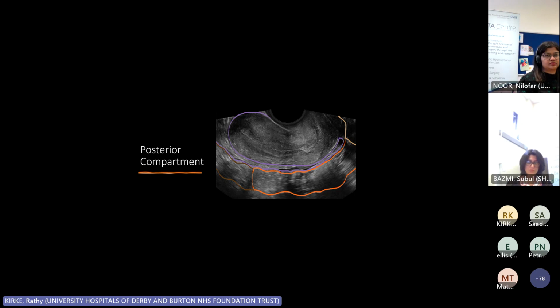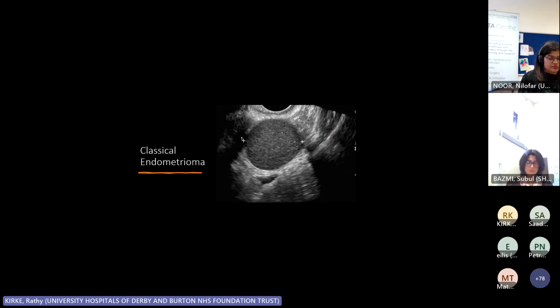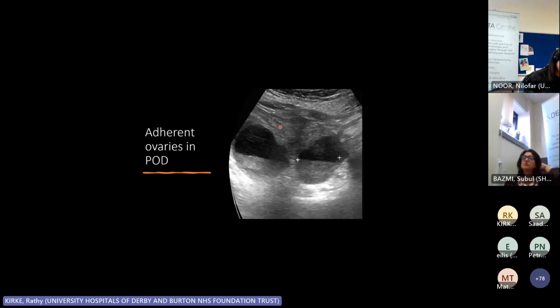And this takes time. So if you look at a classical endometrioma on the ovary, that is what we call a chocolate cyst. This is what a chocolate cyst looks like. It's a nice rounded area with lots of low density gray echoes within. This is just a classical endometrioma, which we can see on ovaries. Now, when we see endometriomas, they can be on ovaries lying in a normal location, or the ovaries might be pulled into the pouch of Douglas posteriorly.